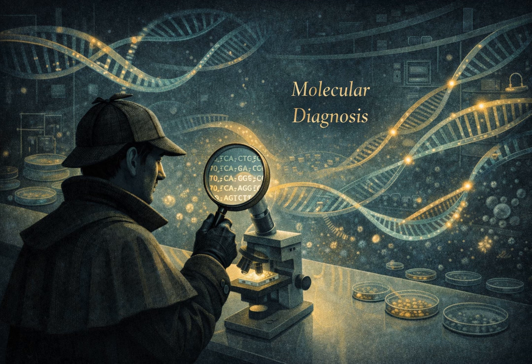The catch comes down to numbers. It's a signal-to-noise problem. Let's say you take a sample of sputum from a patient with possible pneumonia. In that sample, there might only be a few hundred, maybe a few thousand bacteria. So you throw in your probe. You might get a few hundred or a few thousand of those little hooks to stick. And a few thousand microscopic glowing dots. It's completely invisible. It's just not enough signal to be detected by our standard instruments against all the background noise of the gunk in the sputum sample. So the signal is just too weak. It's too weak because we haven't amplified anything yet. We're just finding, and there's not enough to find.